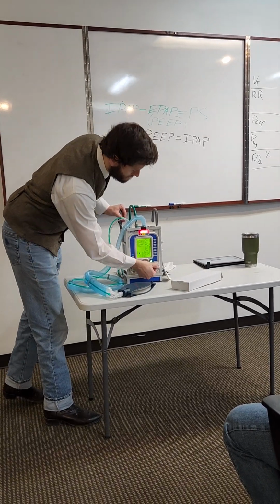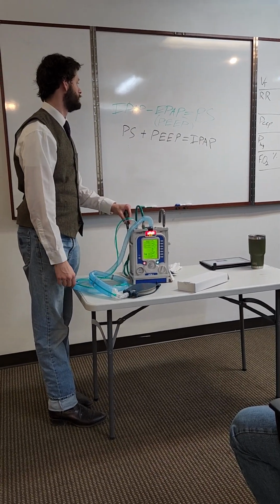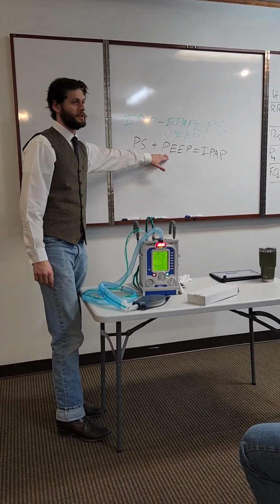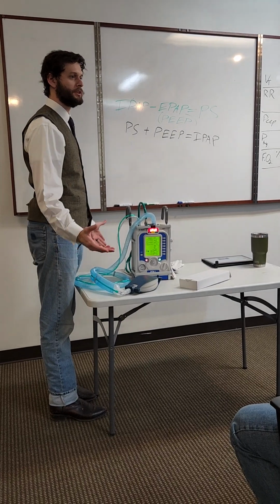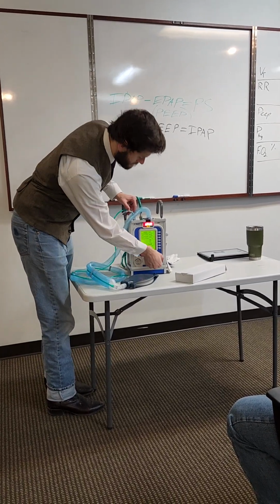So the PEEP and the PS are with the CPAP, is that correct? PEEP and PS, yeah, this is going to be your CPAP mode, or the same thing you'd see on the Newport ventilator as well. Okay. Just making sure.